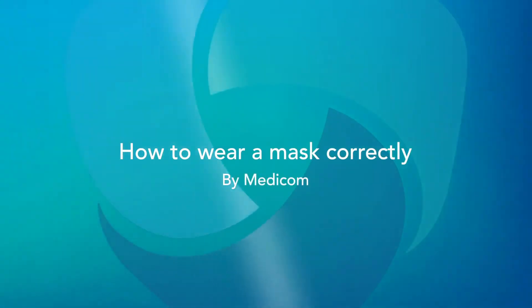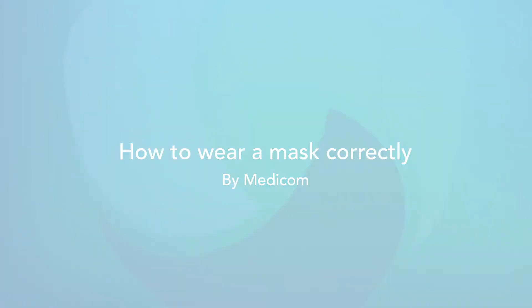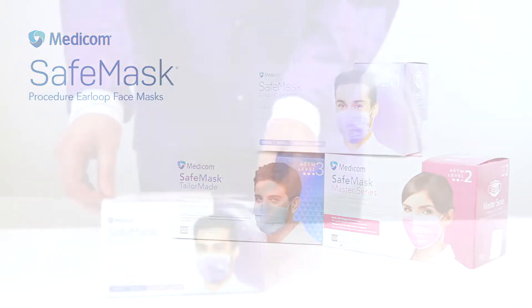How to wear a mask correctly. Introducing the Medicom Safe Mask.